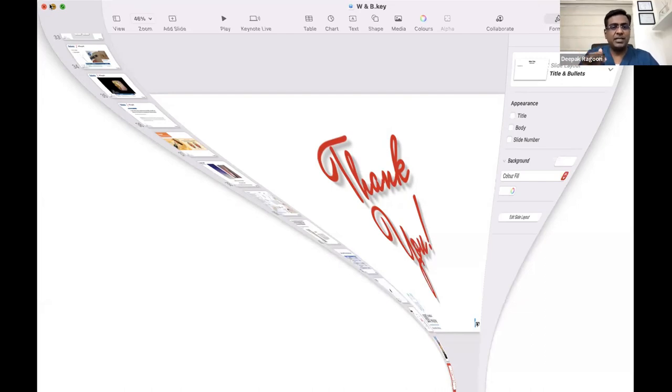If that is getting challenging, a relatively simple, straightforward way of capturing stones in lower pole calyces would definitely be an open-ended basket. Much more relatively safe. You look at the stone, open and capture. That is as simple as that. But a zero tip basket would require more refined movements for you to capture a stone. Yes, I feel it might be a relatively easier job to hold a stone with an open-end basket in the lower pole.